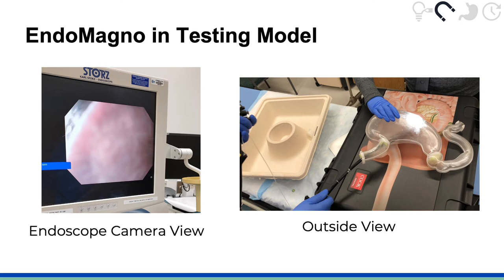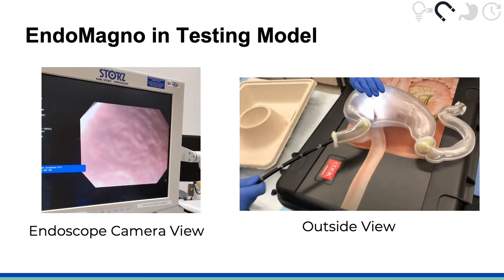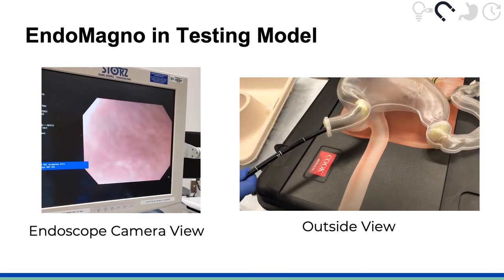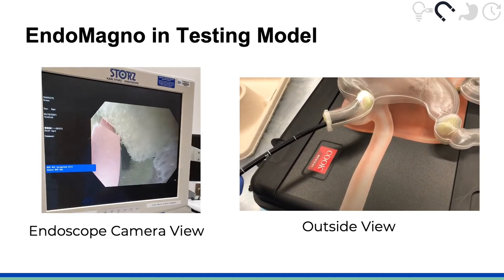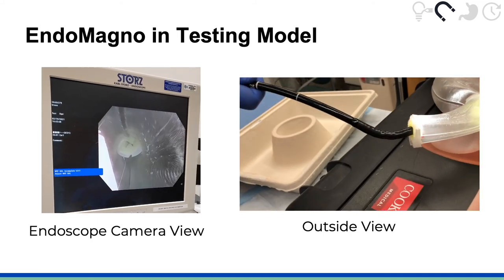The sphincters are modeled using a sponge in our testing platform to mimic their size constraints and deformability. As the endoscope is pulled back out, Endomagno successfully holds onto the button battery even as it moves through both sphincters for extraction from the upper GI tract.